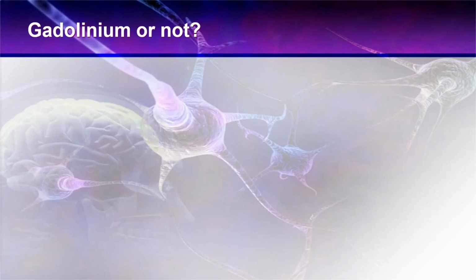There's a question whether to give paramagnetic contrast, such as gadolinium. It's actually not routine in human epilepsy. I mean, they will always not choose to place an IV catheter and give gadolinium if they don't have to in humans, mainly because it requires another level of technical ability. So somebody needs to be there to actually place the catheter, and it's not without risk, especially in a long-lived animal. Such as a human.